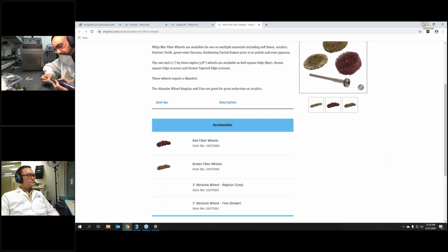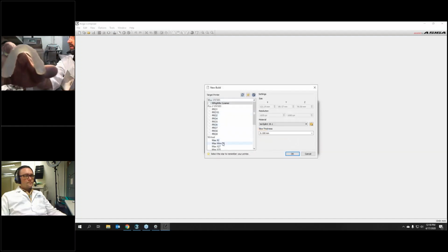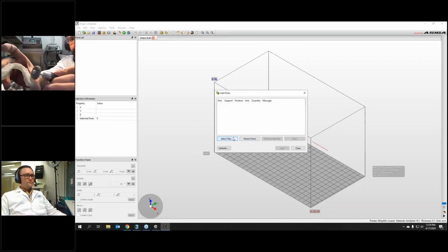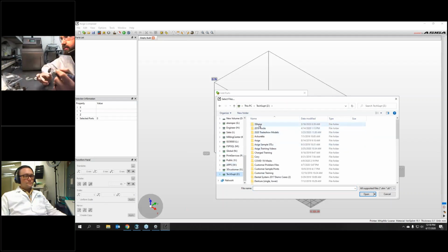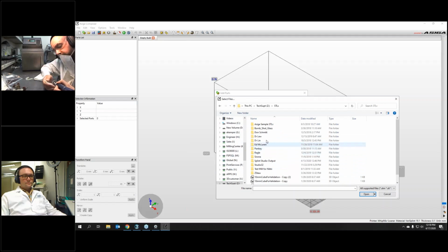So while you're pulling up Composer to show them the difference, I'm just about completed with the brown wheel. If you look close, you can start to see it's got a frosted, matte finish. If you were able to see it firsthand with me, you'd see there are micro scratches on this surface. Something that I'll do is go over it one way, and then go perpendicular to the first way I went on it. That helps hide any deeper scratches. So I've already gone over it in one direction, and now I'm going to finish it off from the other.